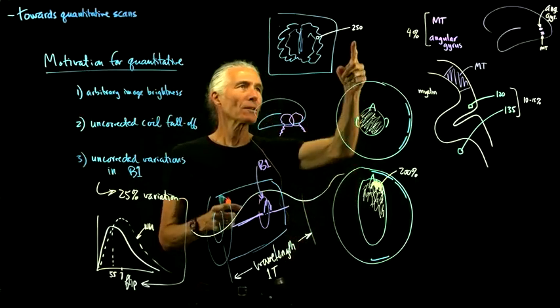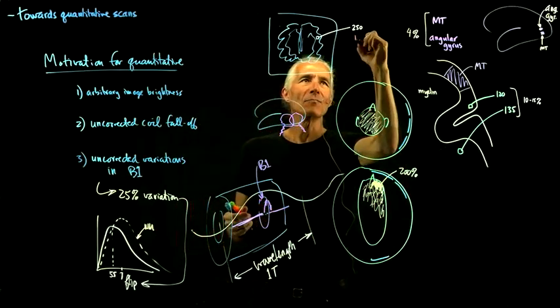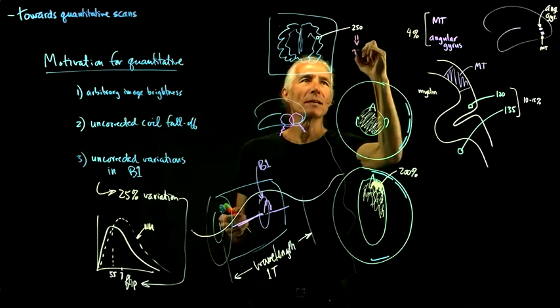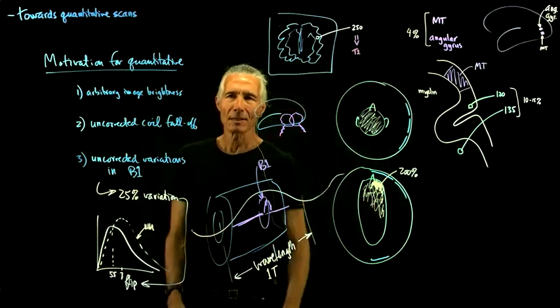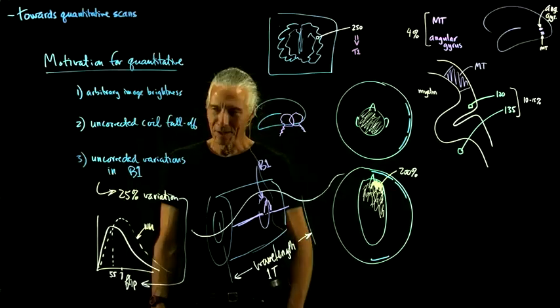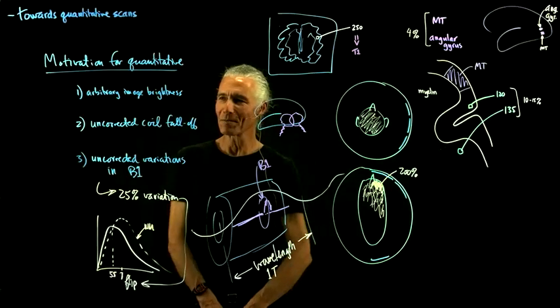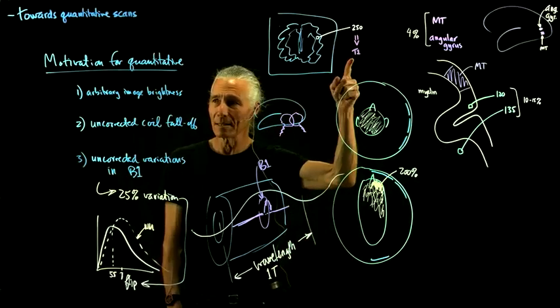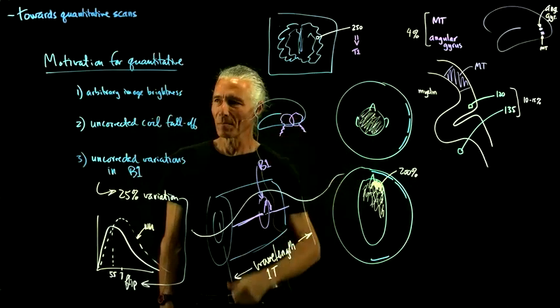In other words, if the number coming out of here was actually T1, then we could do a scan on somebody and then do a scan next year, and we could say, well, Bill, your T1 has gone to hell. You really have to start improving your diet or stop drinking, because you could actually see this difference in an actual number, from year to year.